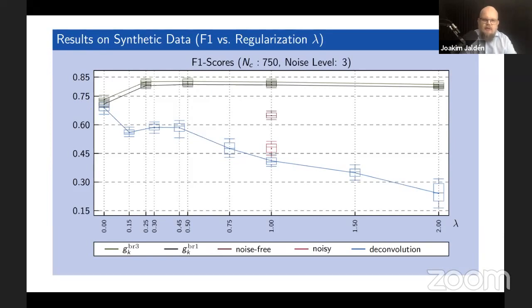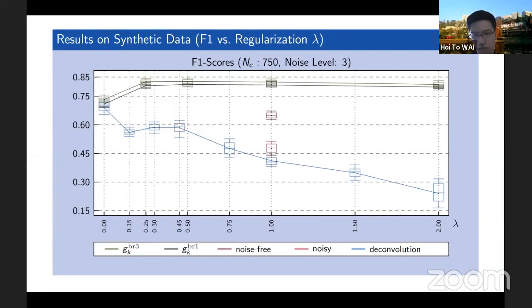This other technique, which is called ELISpot, works the same in the first step, but then you have a staining which leaves black stains on a white substrate, and you image them with visual light. That black staining tends to saturate. So in the imaging process, you don't have as large a dynamic range. So there are nonlinearities that come into the imaging part of the experiment, which is more limiting.